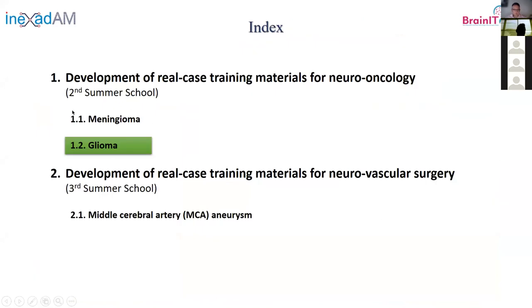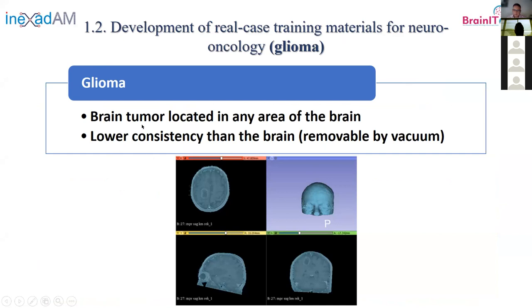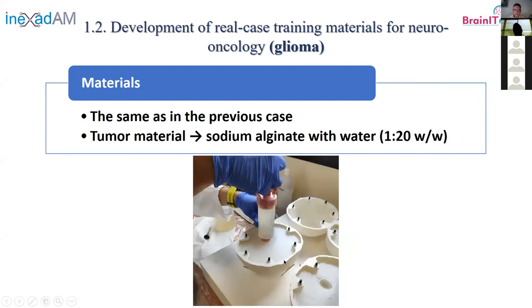The first case is done. The second case is more or less similar — I will go faster. It was a glioma case. The difference is that the tumor is not close to the meninges but in the middle of the brain. In these cases, the consistency of the tumor is usually lower than the brain — they even remove it by vacuum. The idea was to leave a hollow inside the brain and infiltrate a material that could mimic the tumor.